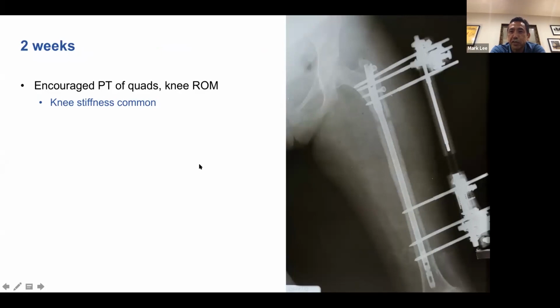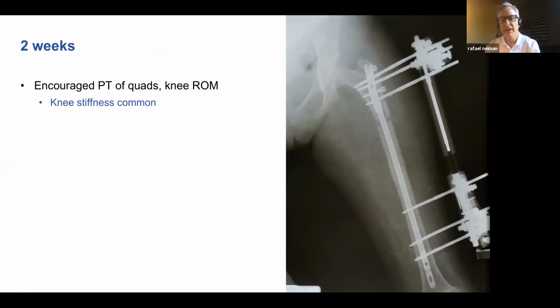Steve, one of the tricks was getting those half pins off. Maybe Rafi, you could share. Sure. In the interest of time, you do want to have the nail in there, and Mark, this will probably make you cringe, but if you can use a cannulated drill bit, you can get a small pin and get it exactly where you want.